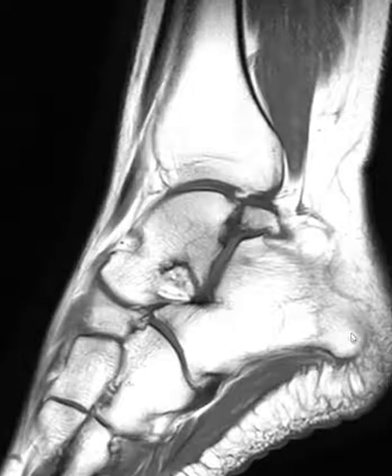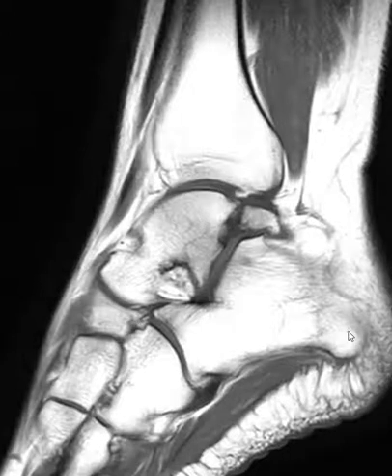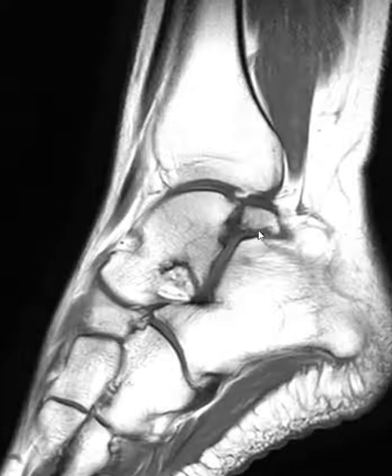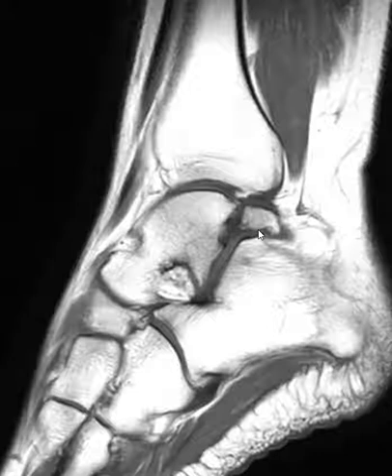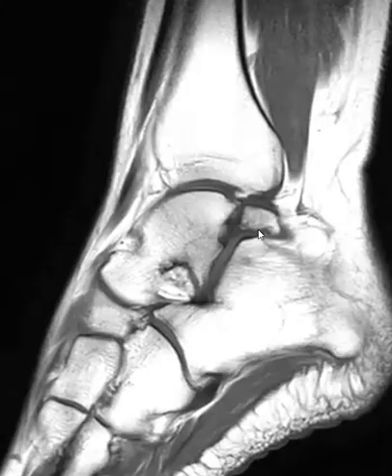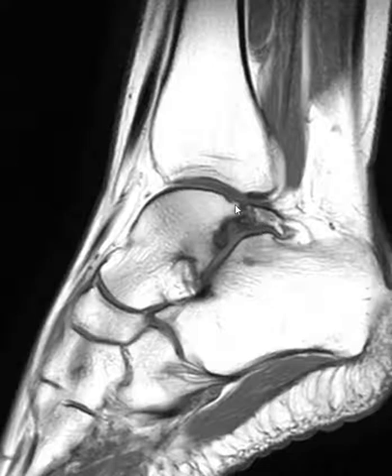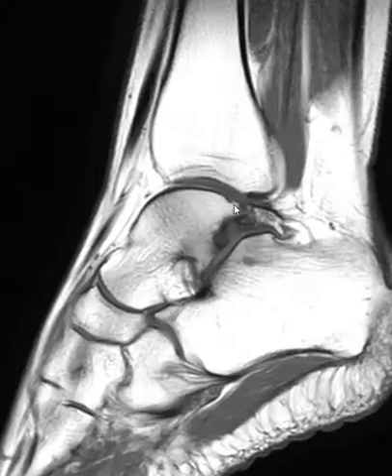Hello, this is Dr. Gay from Forsythic MRI. This is a patient who has an accessory ossification or unfused ossification on the back of the talus. This is called an os trigonum — very, very common. Most of the time they are very small and hard to see, and they can be confused with a prominent posterior process of the talus.